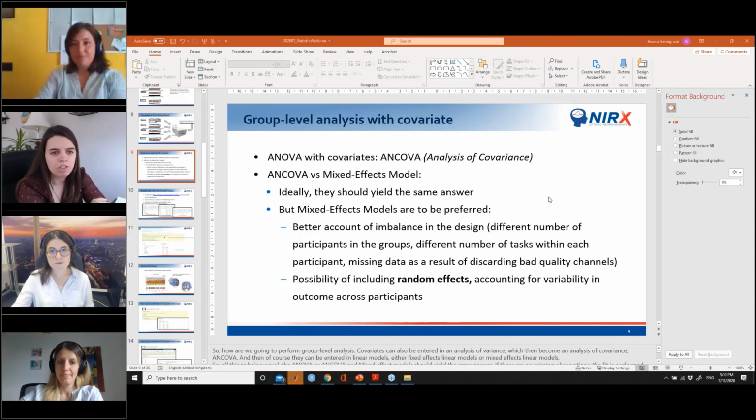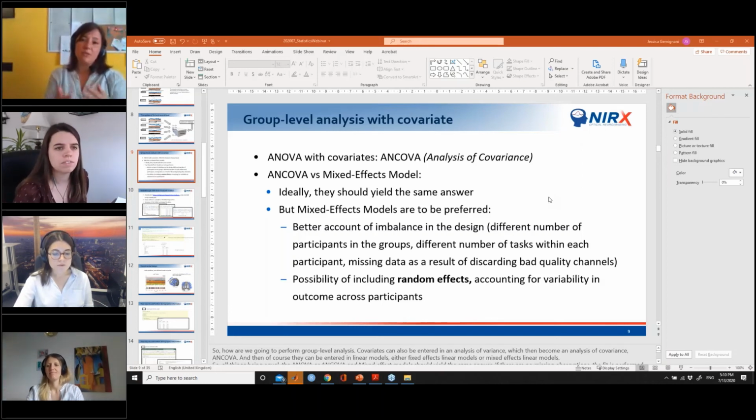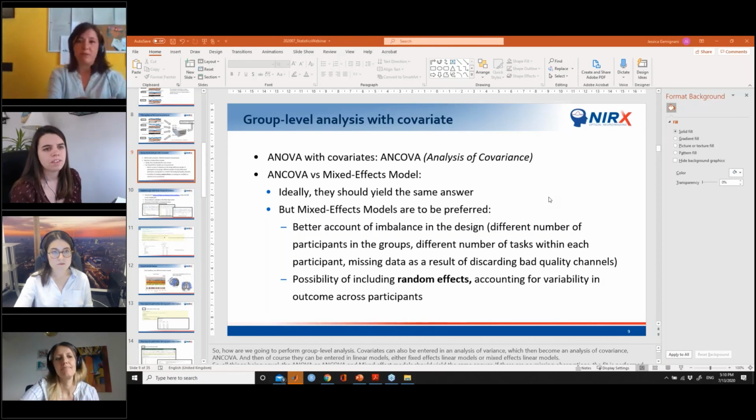No, but that's still very helpful, and like you said, it's about setting up the reference level, because the results of the model are always explained in terms of deviations from the reference.